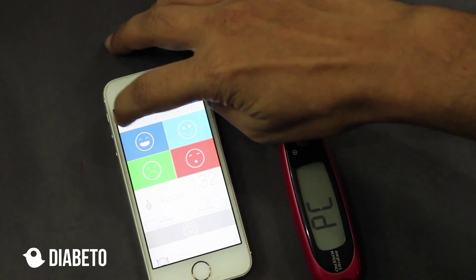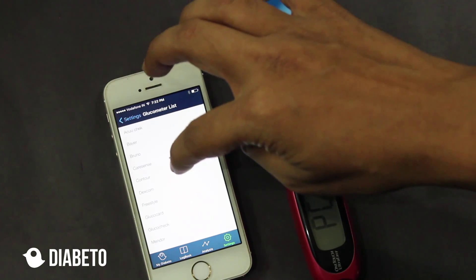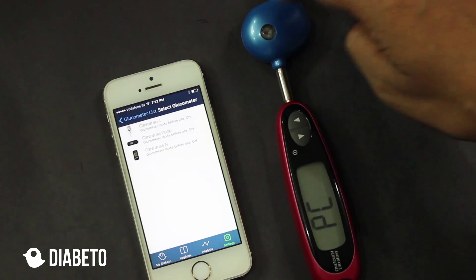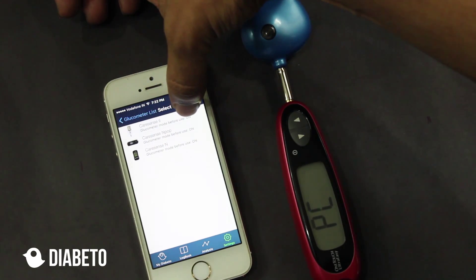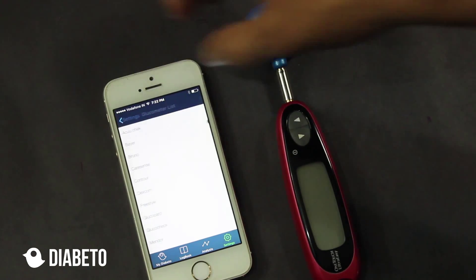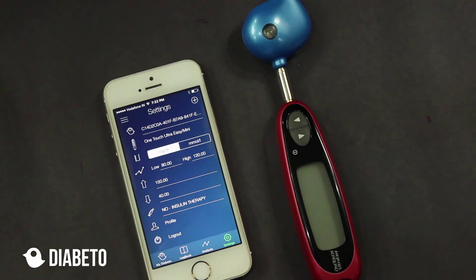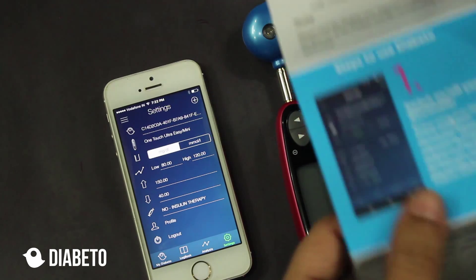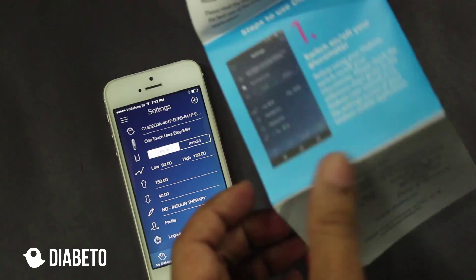There's one important step when you actually select the glucometer: some glucometers need to be switched on while you're taking the reading, like Caresens — it will say 'glucometer mode before use: on.' Some of today's glucometers need to be switched off. That's the only thing you need to take care of, and all these instructions are given in the quick reference guide.